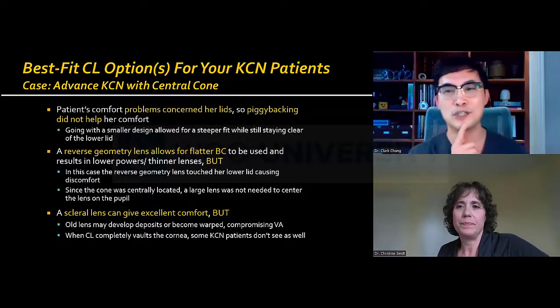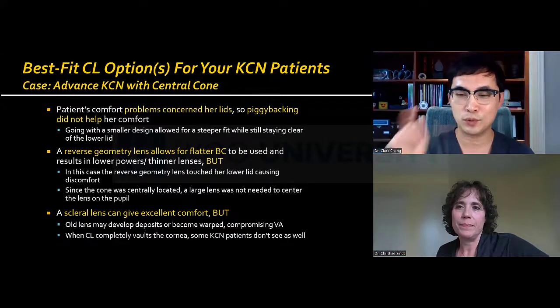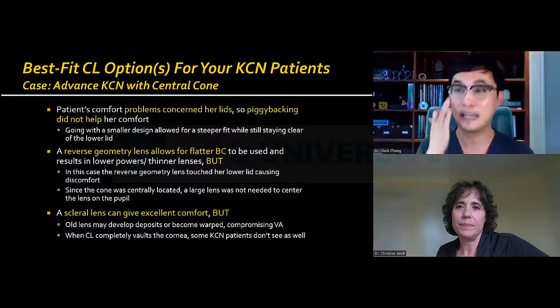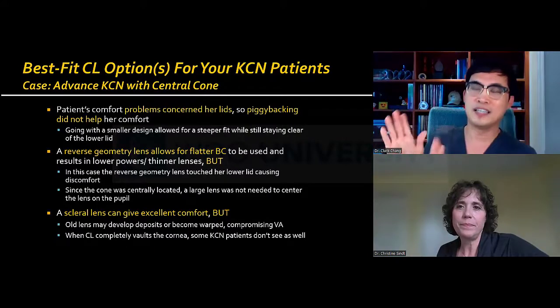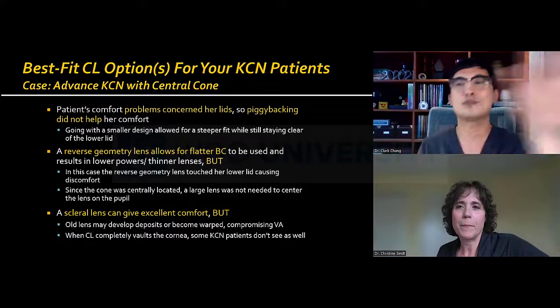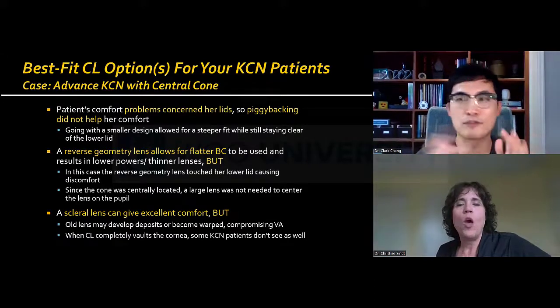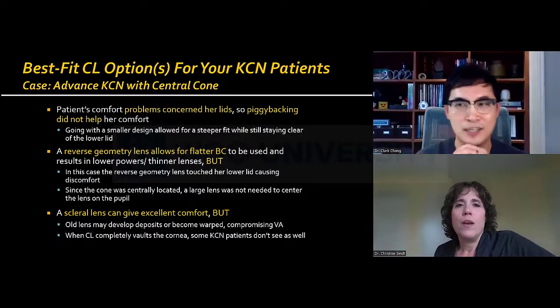But my question for you is, how often do you take the patient's word at face value during chair time, meaning they feel the lower eyelid? Or do you sometimes say, well, I've tried to move the lens up a little bit, you're still feeling the same area. Maybe let's get the lens ordered. Let's have you try a few weeks, then come back. Do you ever give some adaptation time, or do you take their word?